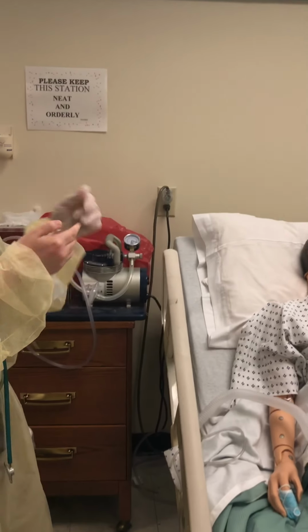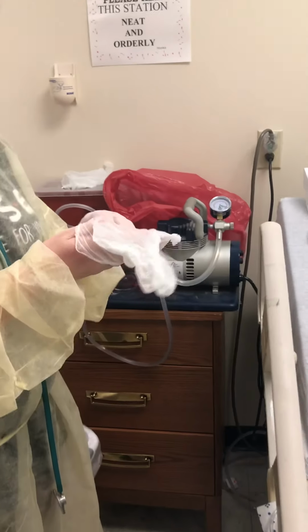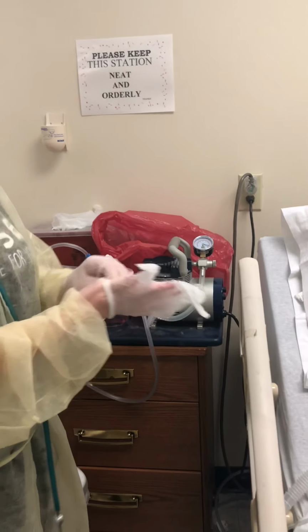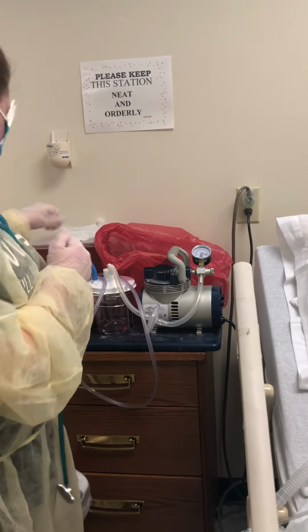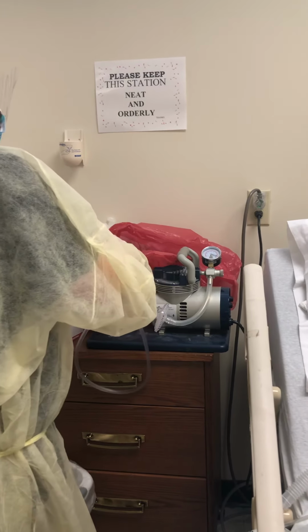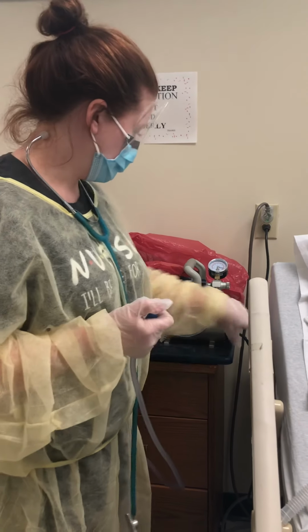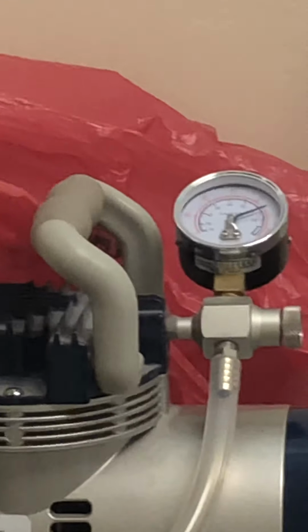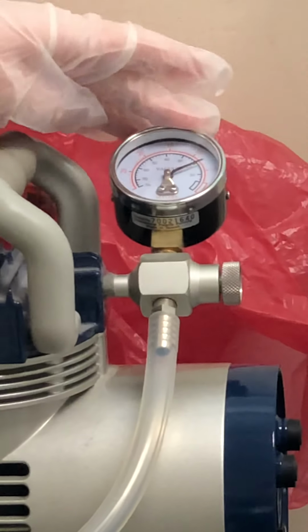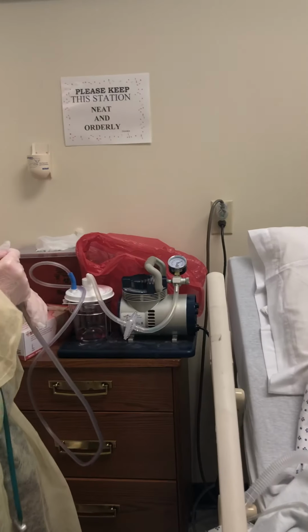And the way that I know the suction is working properly is I'm going to turn it on and occlude the end of it, and it should be between 5 and 10. So I'm going to go ahead and occlude, and it goes up in between 5 and 10, so I know that it is working properly.